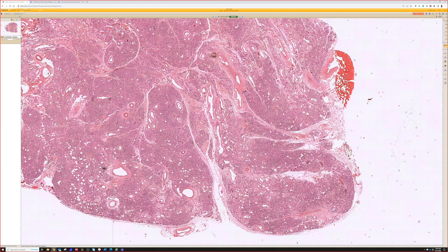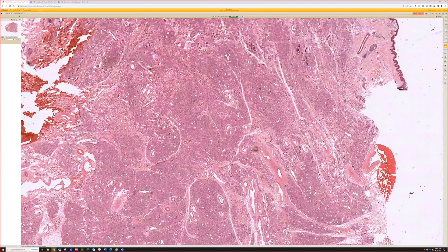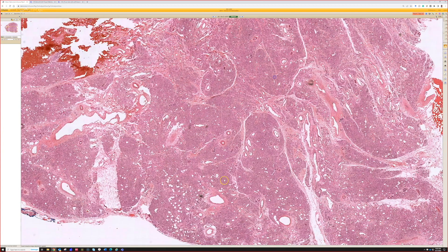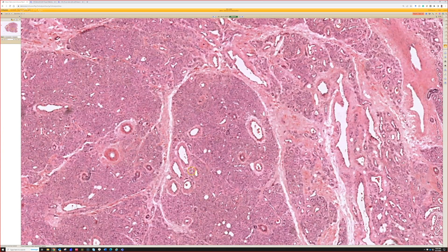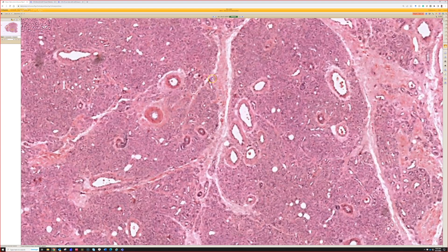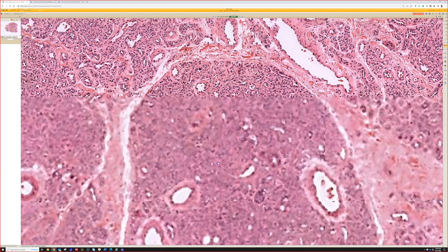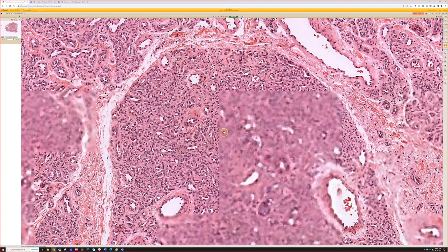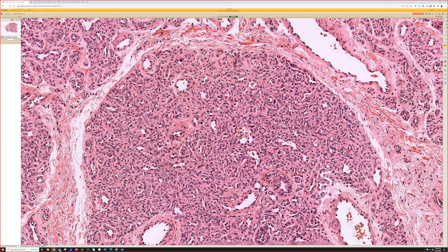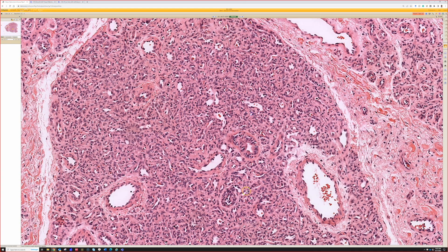Yes, that's a good point. I like that 'plexiform' — there are so many lobules and they're so interconnected that it almost gives an interwoven plexiform appearance. Great description. When we go closer to one of these lobules, we've got the bigger dilated vessels, and as it comes into focus, we can see these are just innumerable tiny vascular spaces lined by endothelial cells, jam-packed together but very monotonous — I'm not seeing atypia here.